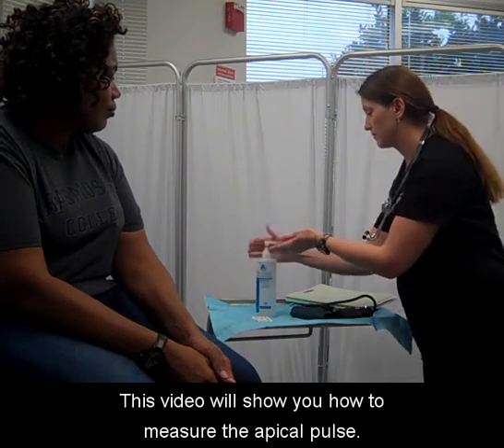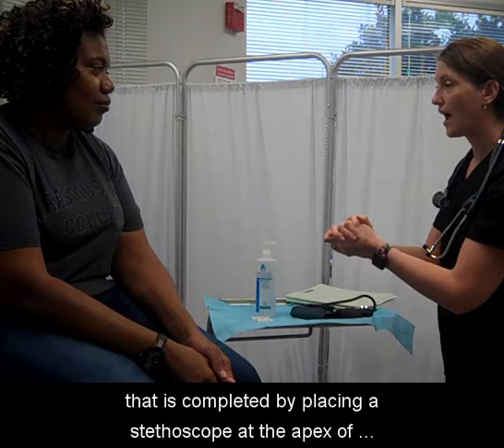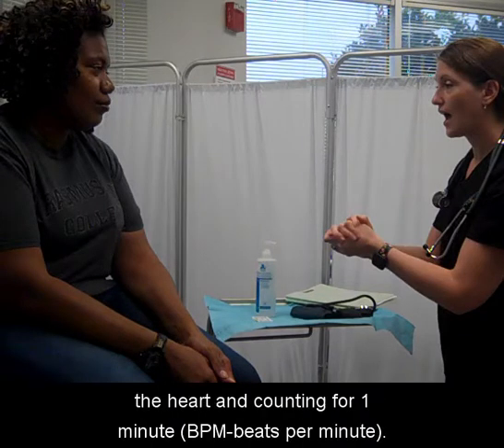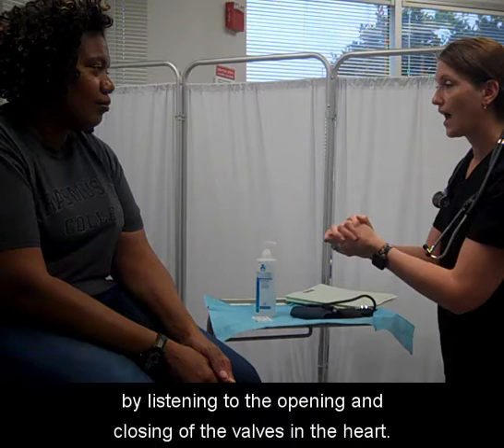This video will show you how to measure the apical pulse. The apical pulse is a measure of cardiac function that's completed by placing a stethoscope at the apex of the heart and counting for one minute. You will be gathering your patient's heart rate or pulse by listening to the opening and closing of the valves in the heart.